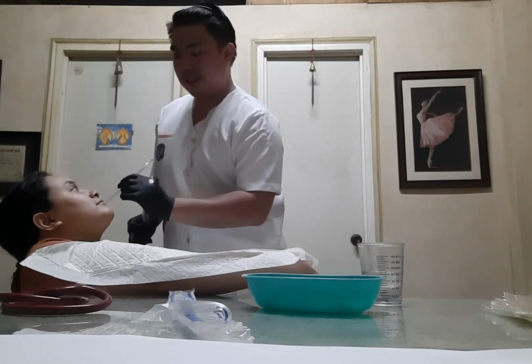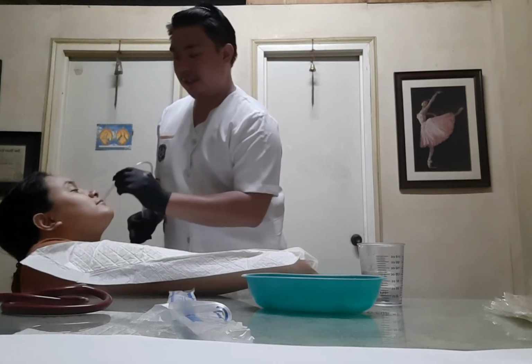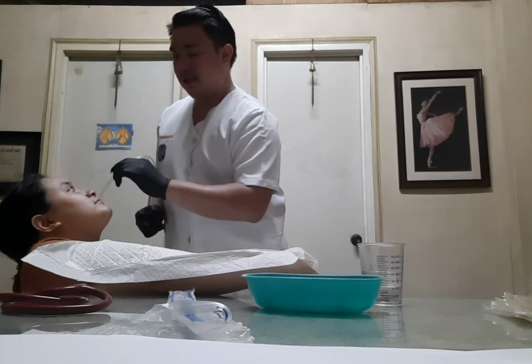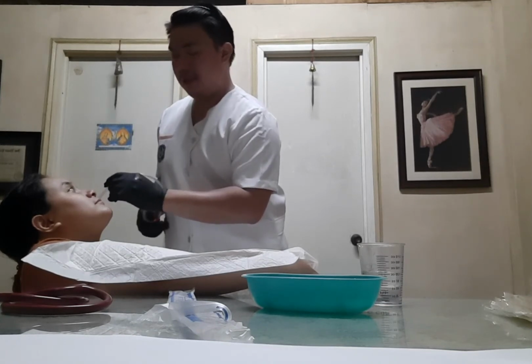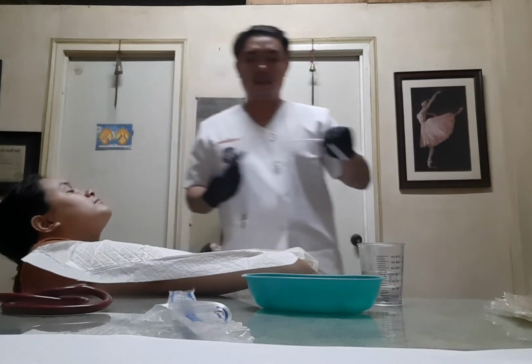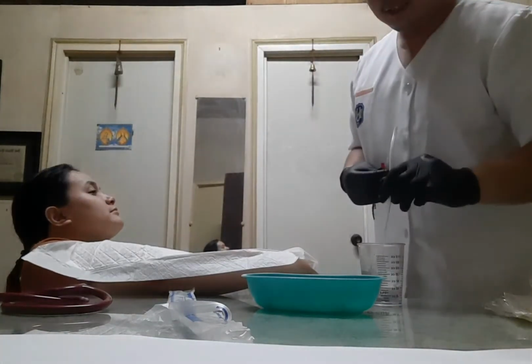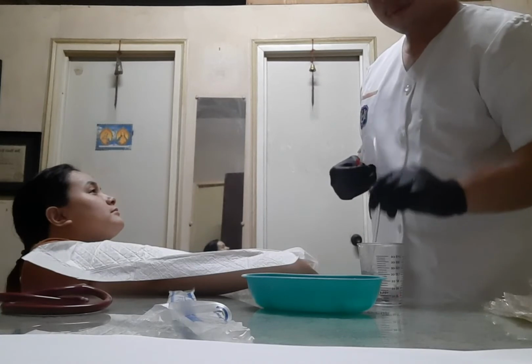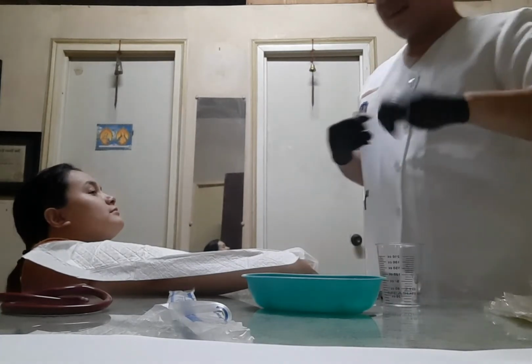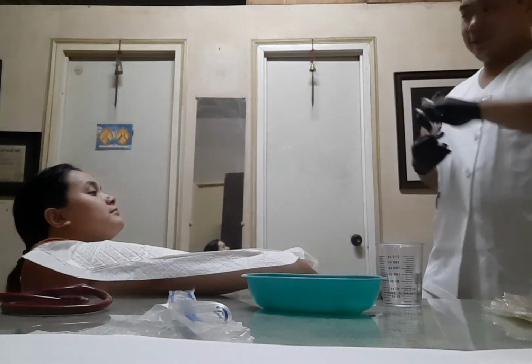And then insert, and then 10 seconds of suction, then up, then place it to the right nostril. Then check for the patient's response.